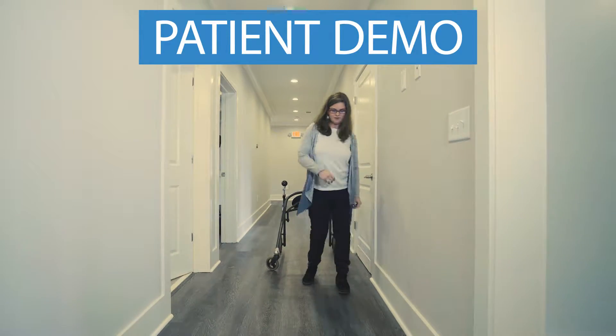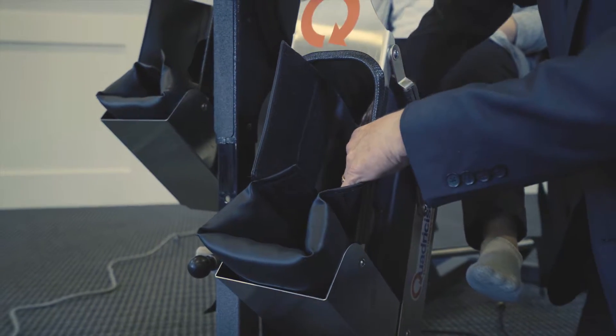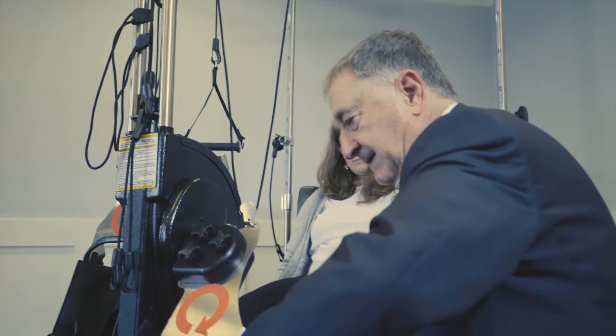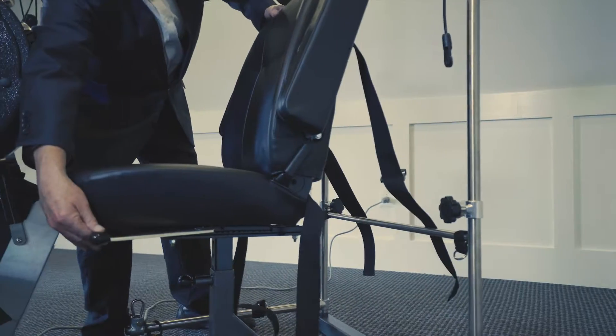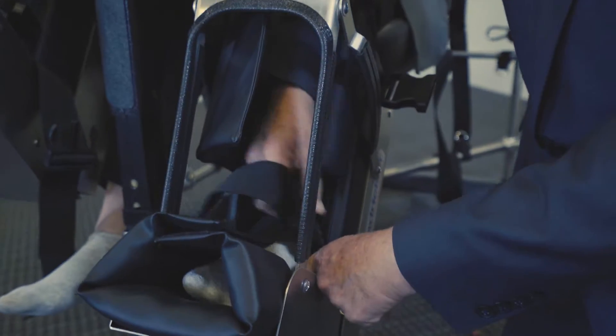Now we have a young lady that we're going to try to help with her gait. The foot cradle has hospital-grade foam in it, so it massages the calf. When we put the ankle in, it fits in a small pocket. So we scoop the seat forward so that the foot drops down into a little pocket.